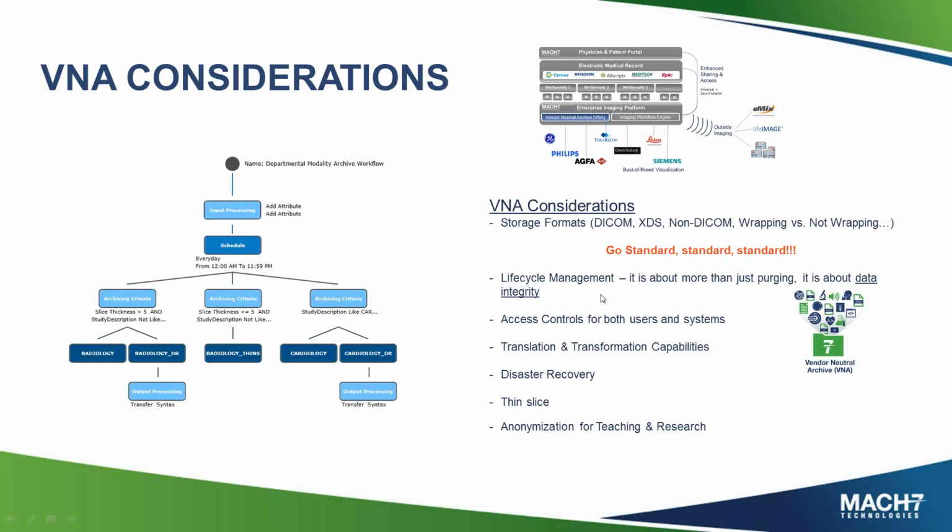From a lifecycle management perspective, I talked about this earlier, it's more than just about purging. It's also about keeping the data up to date, patient merges, patient updates. It's about the access controls. If all of a sudden you have this consolidated image storage device that's storing radiology and cardiology and pathology and wound care and so forth, there needs to be some way of controlling access to it. If I'm a radiology PACS querying the VNA, maybe I shouldn't see what's in dermatology, or dental, or cardiology in my C-FIND results that come back. So how can you control that access? How can you also control access for the users? And not only just be restrictive, but also just clearing out the noise. As a physician going into a system and looking at a work list, they may not want to see all the imaging data from these different specialties.